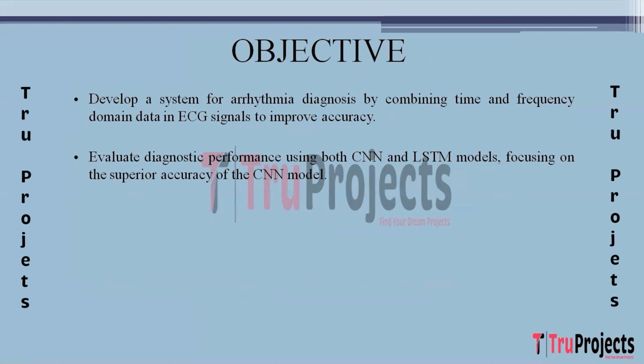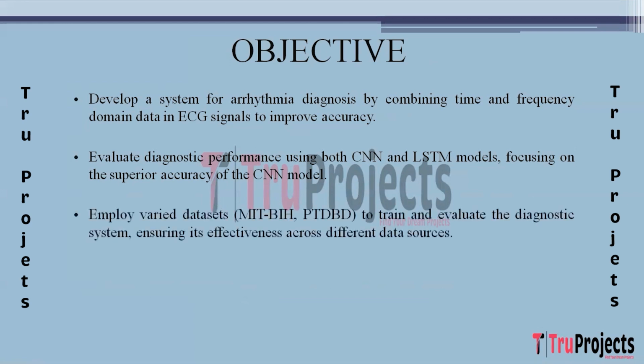The project seeks to compare the performance of convolutional neural network and long short-term memory models in diagnosing arrhythmia. The project aims to utilize diverse datasets including MIT-BIH and PTB-DB for training and evaluating the proposed diagnostic system. The objective is to ensure the robustness and generalization of the model across different datasets, enhancing its applicability in real-world scenarios.